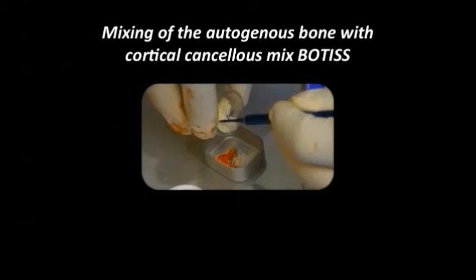At the same time, I'm gonna start using a mix of allograft with the autogenous bone. As we all know, the autogenous bone is resorbing very fast, so I like to use something to maintain the volume and to maintain the scaffolding of the area in order to facilitate the bone growth in that area. I always do a 50-50 mix.